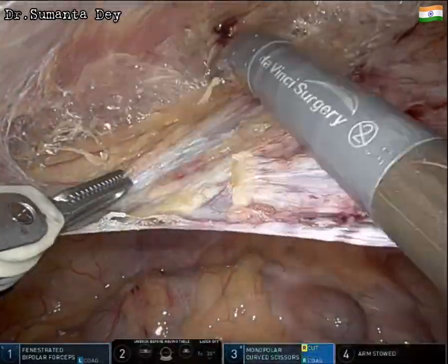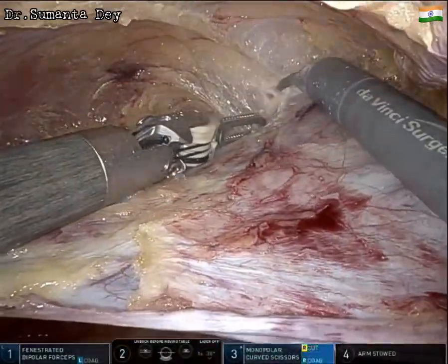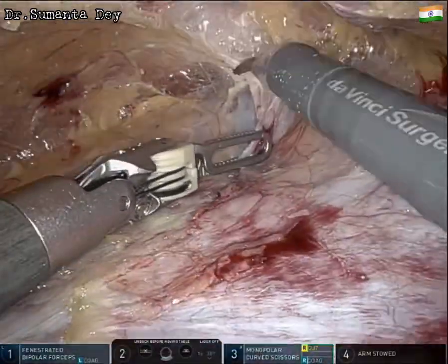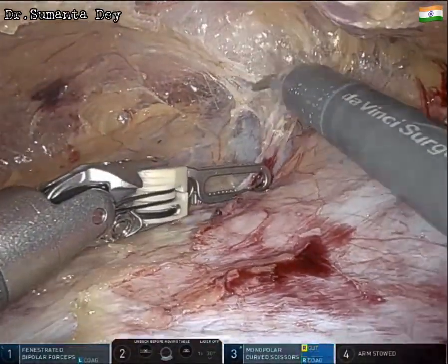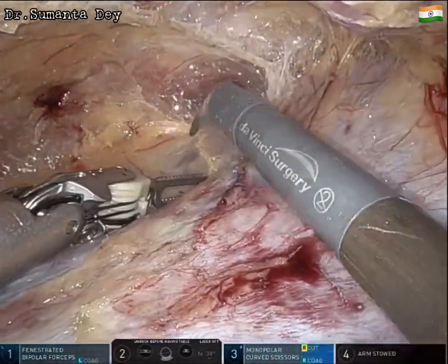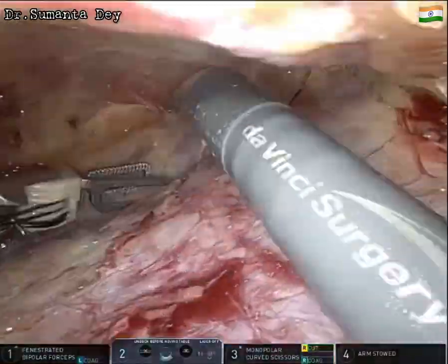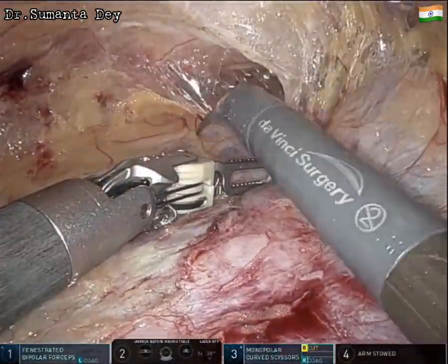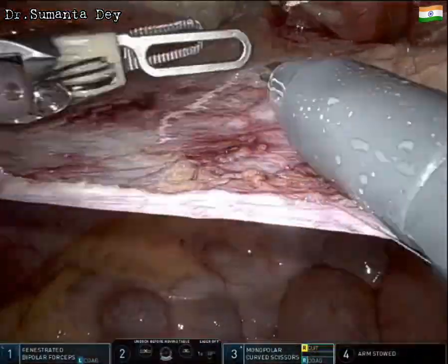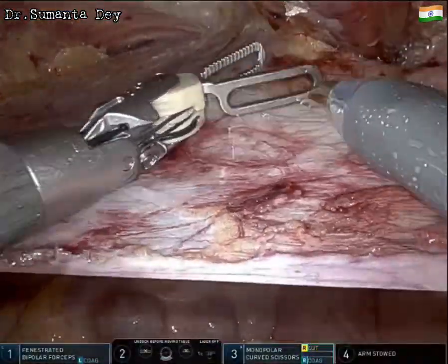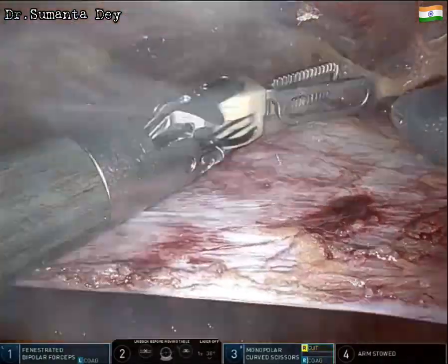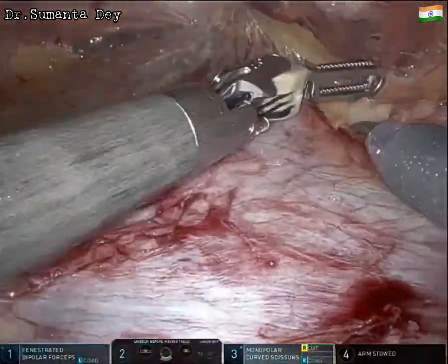A 30-degree up camera was used initially to raise the flap; as we go deeper into the pelvis, the camera direction is changed to 30-degree down. Following the loose areolar tissue plane and staying between the two layers of transversalis fascia, laterally the space of Bogros is created and medially the space of Retzius is created.